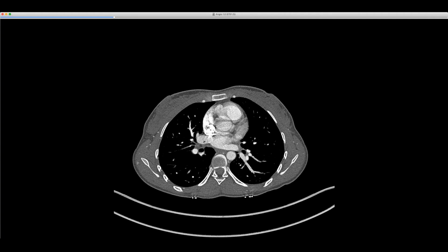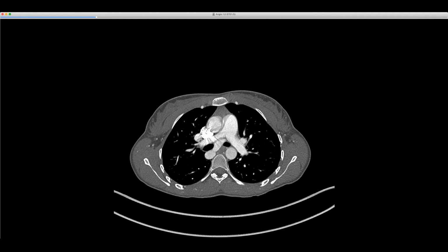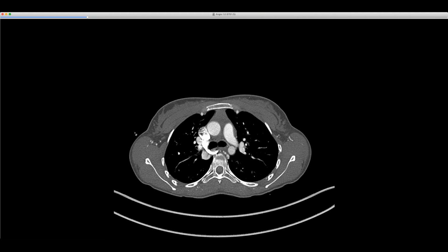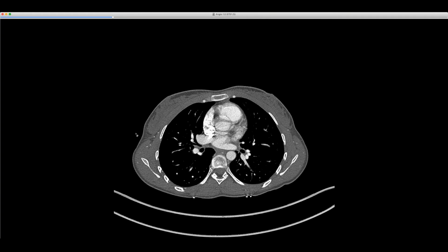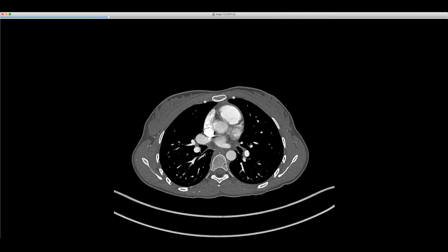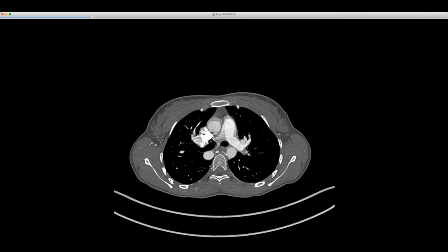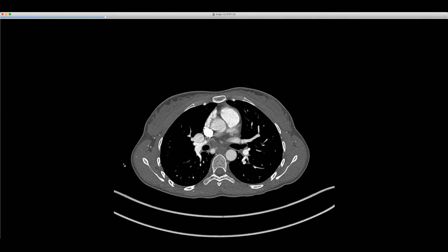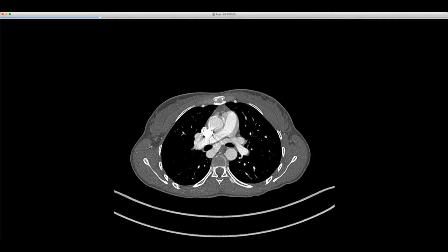Yeah, and then here's what would be the superior, but then it accepts all the rest of the flow. Sometimes with these meandering veins, I look and I see that at the ostium there's sometimes a stenosis of the pulmonary venous ostia right near where it meets the left atrium, and so it's just kind of an accessory pathway. But this is clearly not.